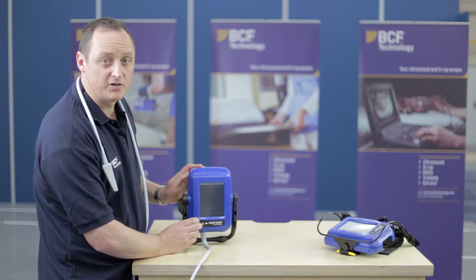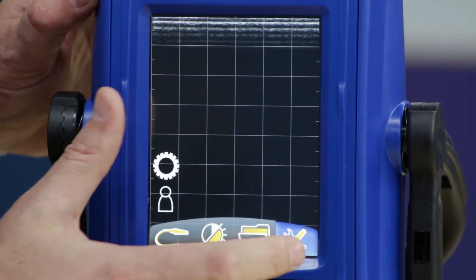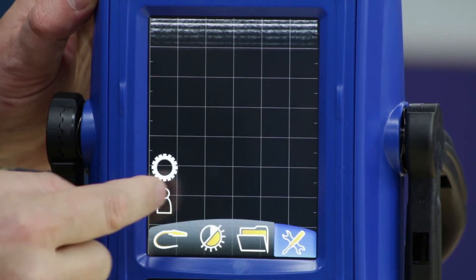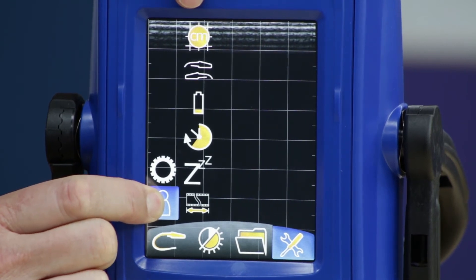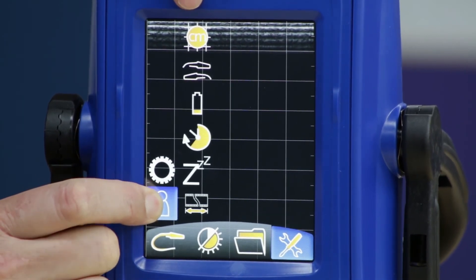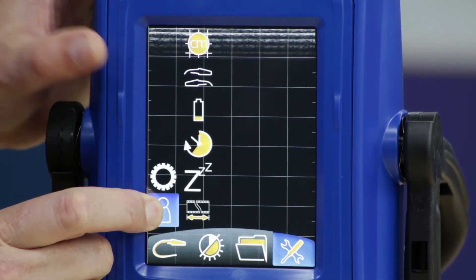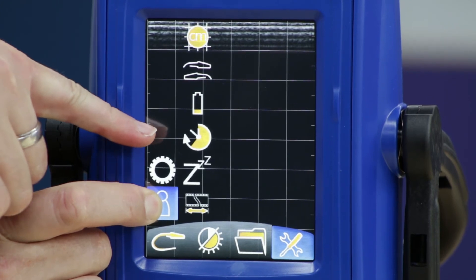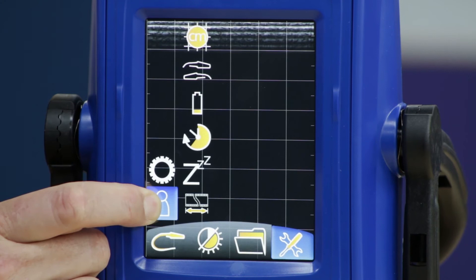Now we'll look at the settings option, which is the fourth tab along the bottom. Click on the screen, click on your tab, click the human icon, and this will show you your centimeter grid square. Depending on the size of the grid that you'd like, you also have probe orientation, battery level, timer, snooze function, and measurement function. You can select any of these and make adjustments as necessary.